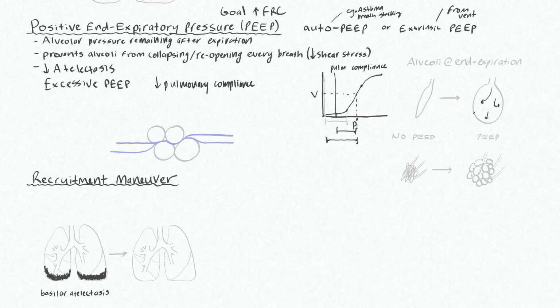A fully inflated balloon is going to have very low compliance. So if we fully expand our lung volumes using very high pressures, and then we try to somehow squeeze even more volume into them, it's just not going to work. There is definitely a finite amount of air that you can fit into somebody's lungs. So if you deliver an excessive amount of positive end expiratory pressure, we may be holding someone's FRC up at a very high volume like this.